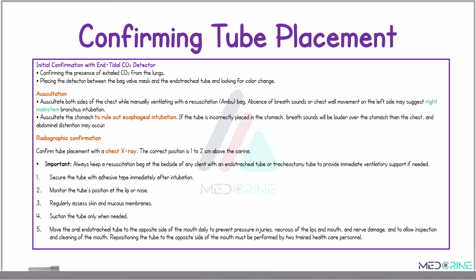After confirming correct tube placement, we then secure the tube with an adhesive tape immediately after intubation. We monitor the tube's position at the lip or at the nose and regularly assess for skin and mucous membrane changes. We suction the tube only when it's needed.